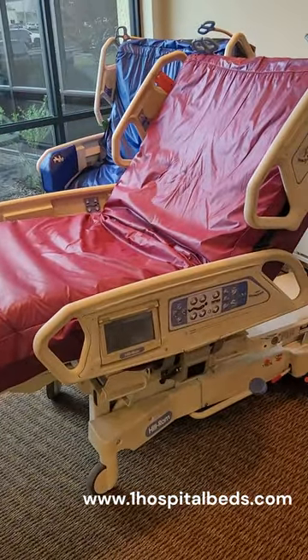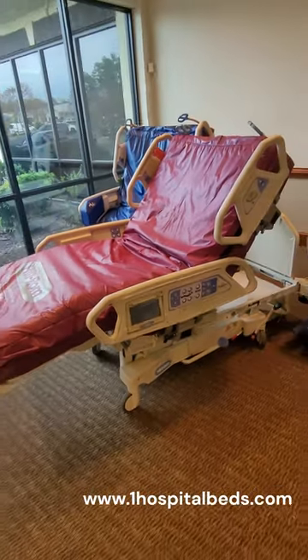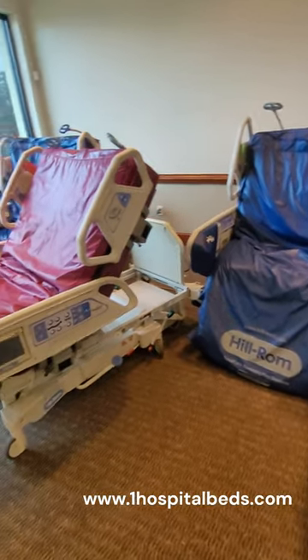These beds have a percussion vibration feature. It's a pulmonary feature used a lot for COPD and different types of ailments — ALS, MS. We use these beds a lot for that.